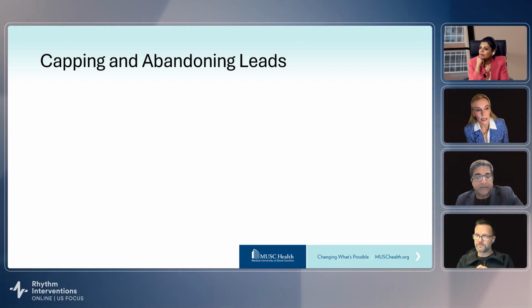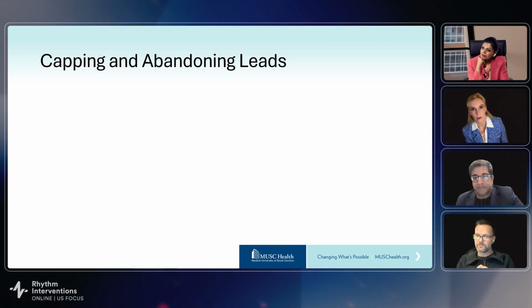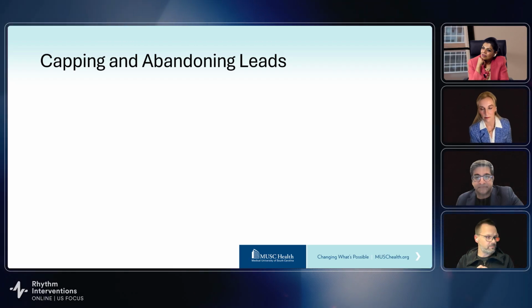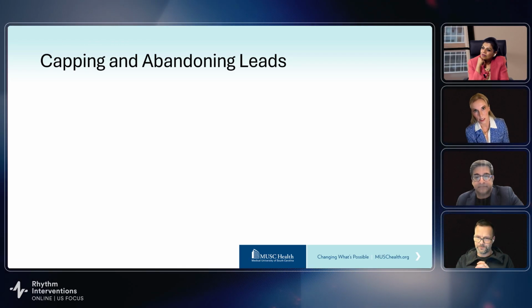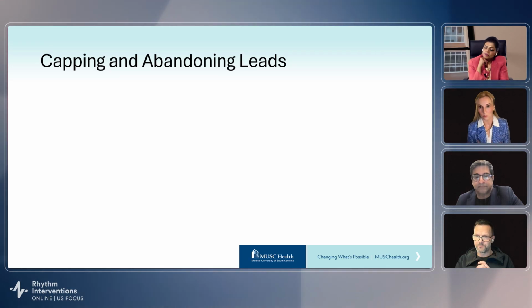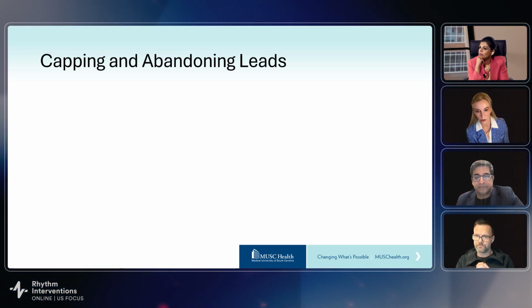No, I mean, I am pretty slow and gentle. But even still, there's going to be some kind of trauma, obviously, to the venous system. We worry most about any sort of injury to the SVC, and that's my first go-to: get that balloon up there and inflated. I always have the balloon prepped and ready to go and staged in these types of procedures.